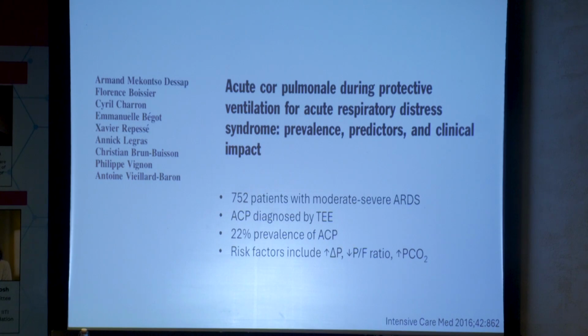During the placement of a PA catheter, you often see transient ectopy, transient ventricular arrhythmias, irritability of the right heart, which tends to resolve once the tip of the catheter makes it into the pulmonary artery. So putting a really large cannula into the RV with really high flows going through it, I think would cause a lot of irritability of the right ventricle. Probably for that reason, there's been no commercial product designed to terminate in the right ventricle. Highly arrhythmogenic.